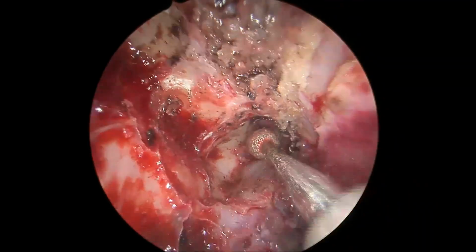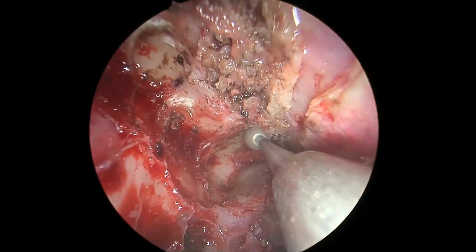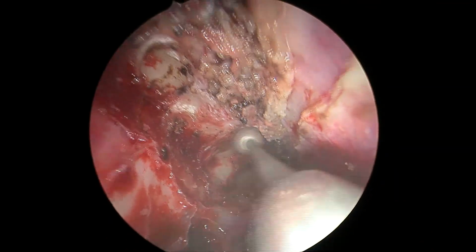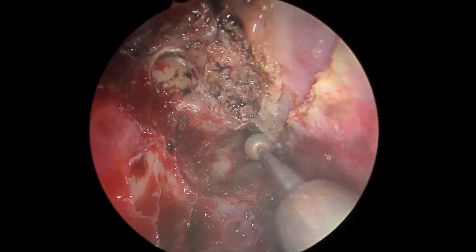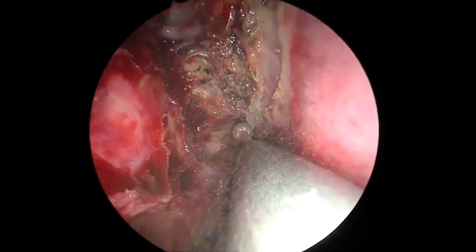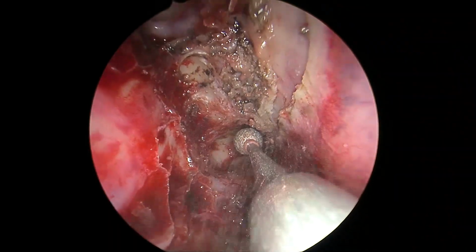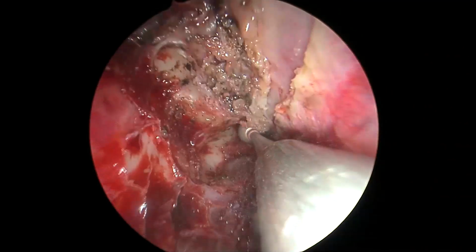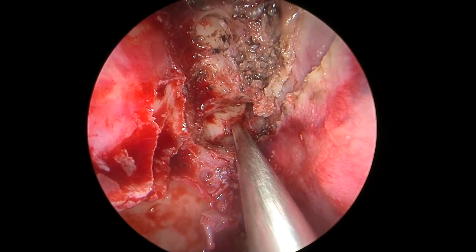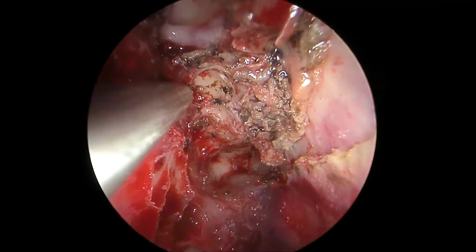Once again, we use a diamond burr to further smoothen out the boundary between the sphenoid planum and the posterior ethmoidal roof, to be doubly and triply sure that the entire bone is smooth and well receptive for our fascia lata graft. The adjoining part of the superior septum with the sphenoid and the posterior ethmoidal roof is now being drilled, just smoothened barely for adequate graft placement. Last bit of hemostasis, to check that there is no bleeding that we need to take care of before we place our grafts.